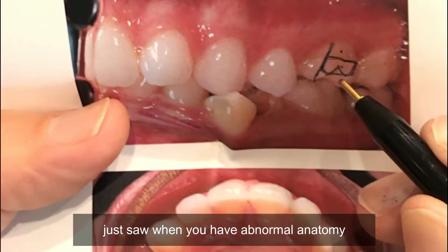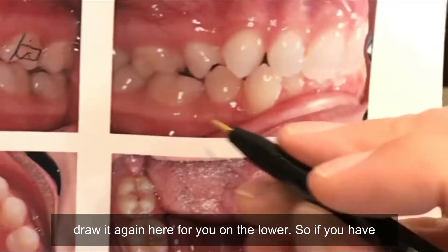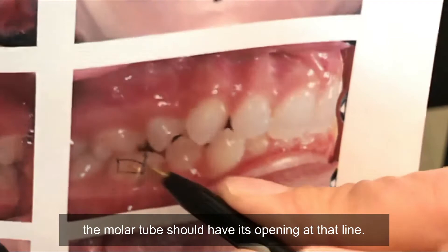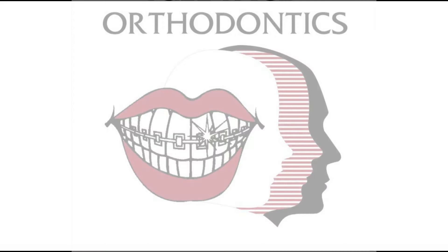But as the case you just saw, when you have abnormal anatomy on the tooth, always use that line — and I'll draw it again here for you on the lower. So if you have that imaginary line through your mesiobuccal cusp, the molar tube should have its opening at that line. Not the mesh pad, but the actual opening of the molar tube.